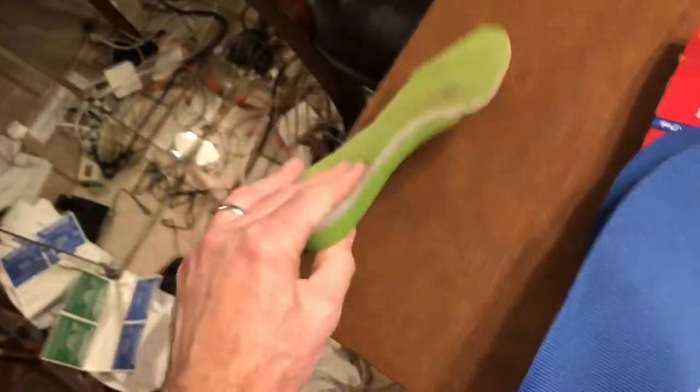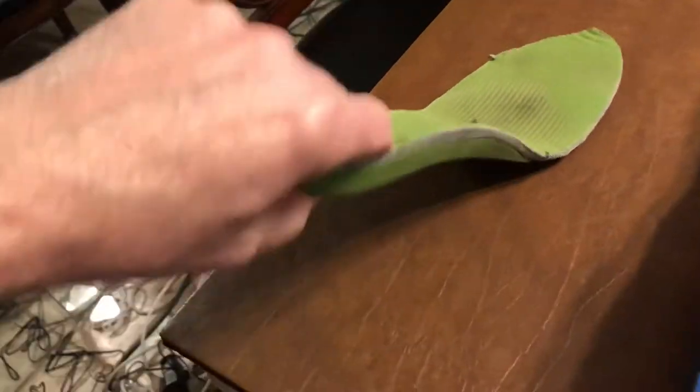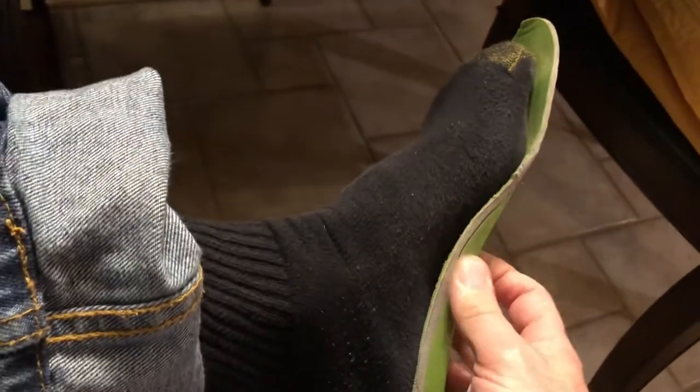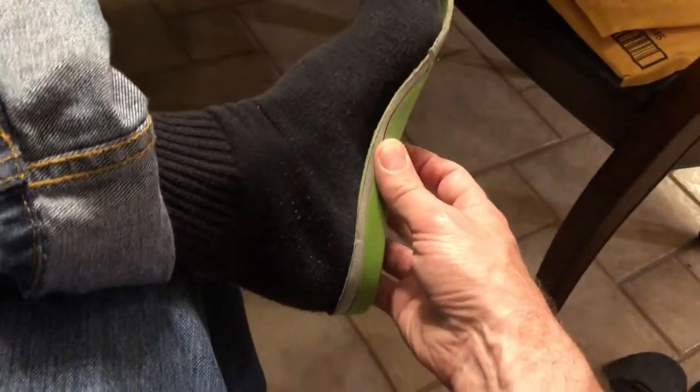One of the big things to consider for plantar fasciitis support is preventing it in the first place by keeping the middle of your foot from flexing, while still allowing the toe to flex. Another important thing for me is that I actually have incredibly high arches — stick a finger in there — so I need real support, and even Superfeet don't really reach my arch.